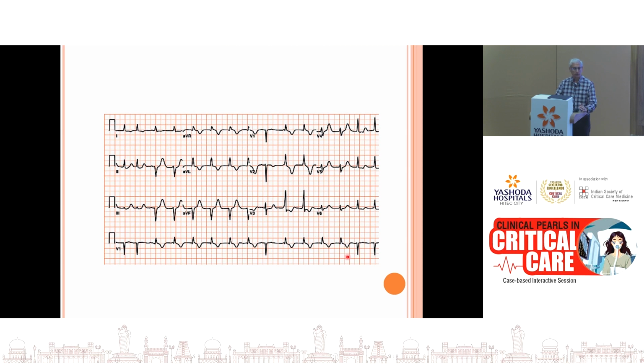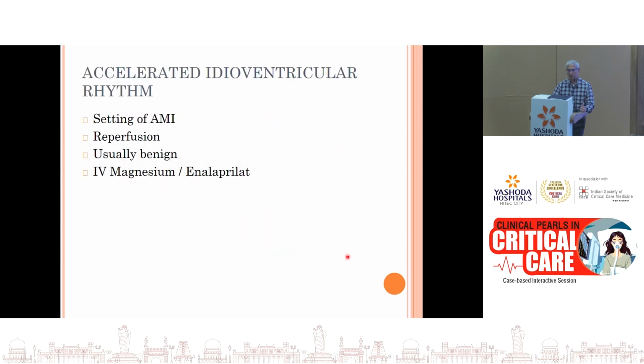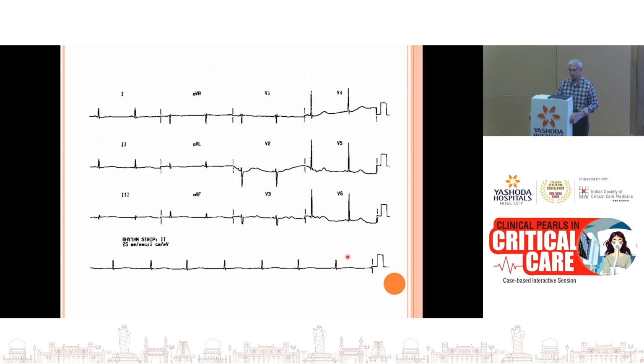And it's not hemodynamically disturbing, this kind of rhythm. So whenever the sinus rhythm accelerates, the accelerated idioventricular rhythm disappears. So this typically happens in the setting of an MI, and the treatment is often intravenous magnesium.